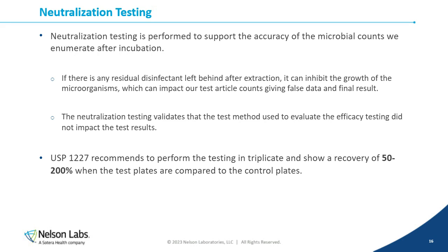And it might show that your device is safe to use when perhaps it is not safe to use. So that's why it is very important to do. The criteria for neutralization testing comes from USP 1227, and you just need to show a recovery of 50 to 200% when the test plates are compared to the control plates.